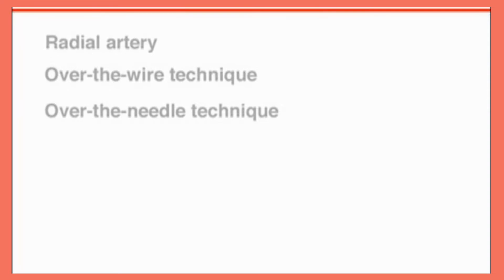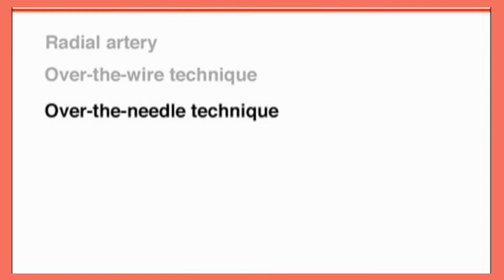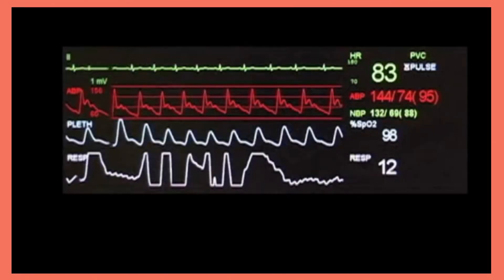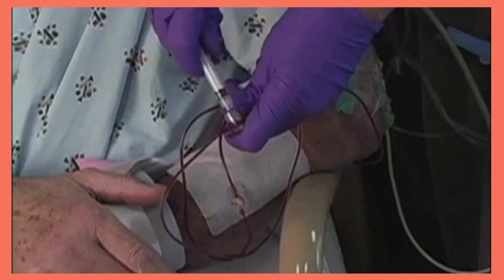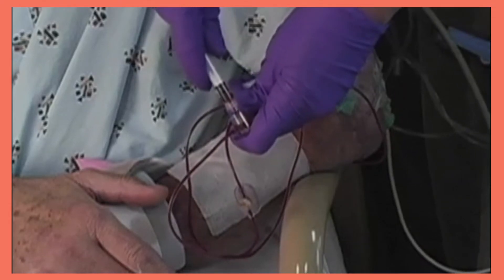This video will demonstrate arterial line placement in the radial artery using two of the many techniques available: an over-the-wire technique and an over-the-needle technique. Placement of an arterial line is indicated for continuous monitoring of arterial pressure and direct arterial blood sampling.